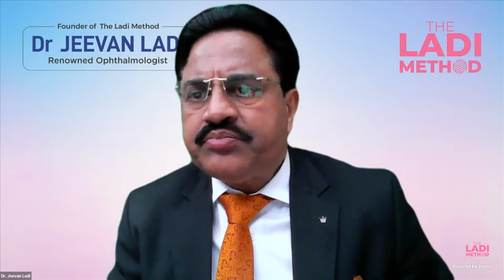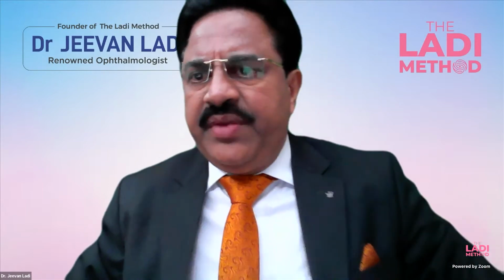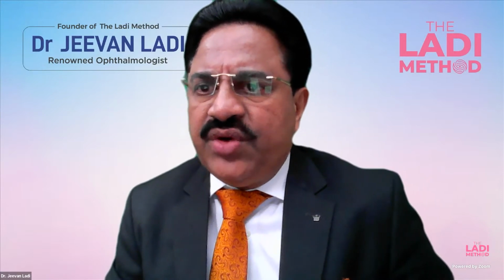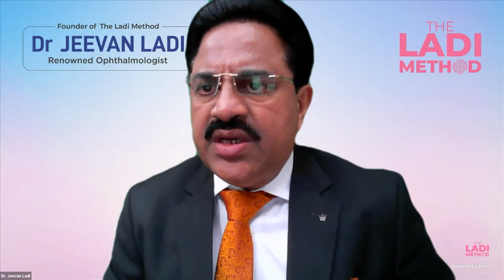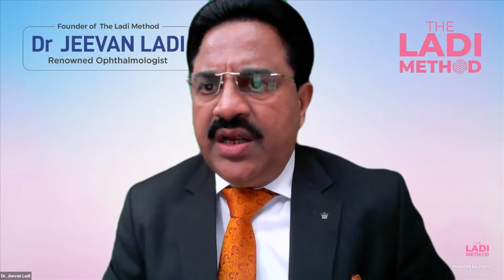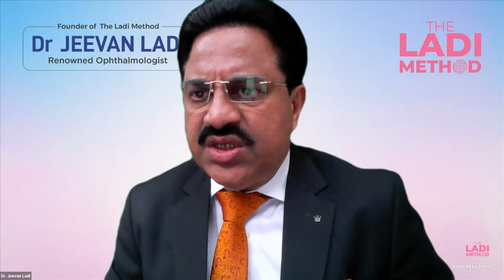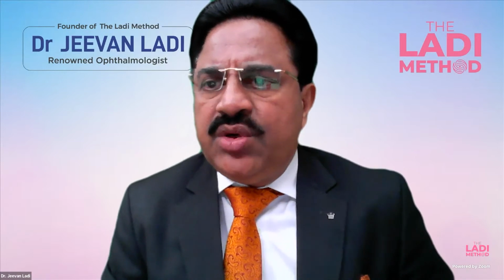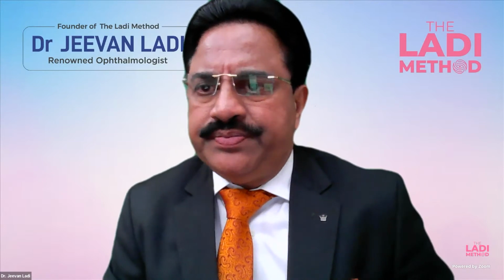Sir, if you have done an RK, the total equations are different. There are different formulas. I use my own formula, which has been accepted and published. That is, if this is a 4 incision RK, increase power by 1. If it is 6 to 8 incision RK, that is radial keratotomy incision, increase the power which you are regularly getting by 1.5 to 2 diopters. If it is 10 to 16 incisions, then you can increase the power by 2 to 3.5. Anything more than 16 incisions, I prefer to use 3.5 to 4 diopters more.